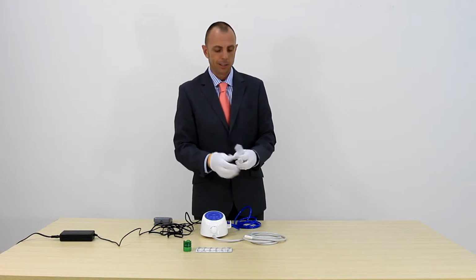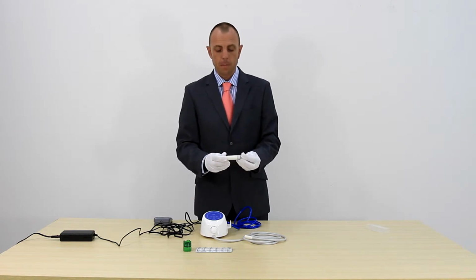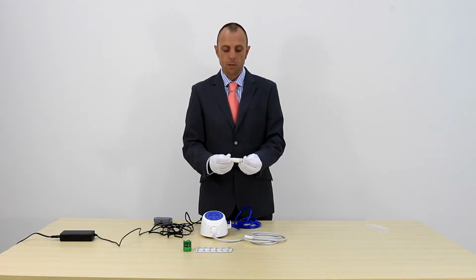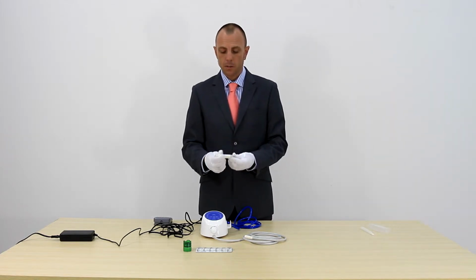it carefully, place the box to one side, and remove the handpiece from its protective shroud within the box. Just have a quick look at the handpiece, make sure everything's okay.